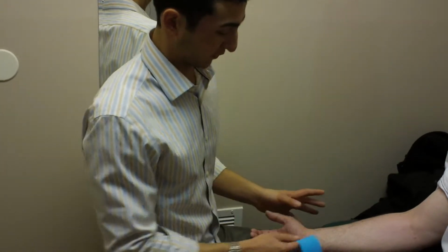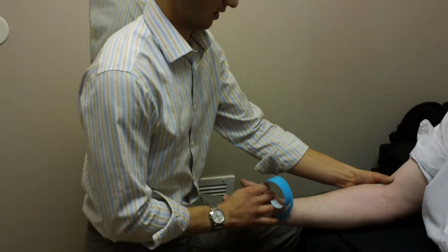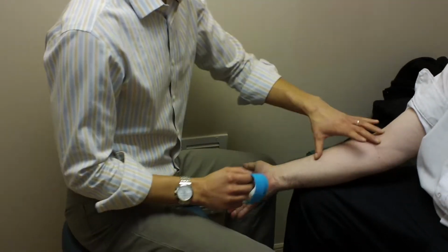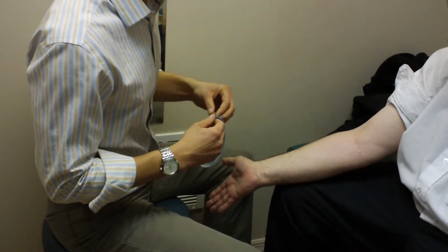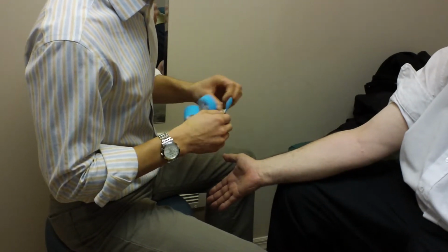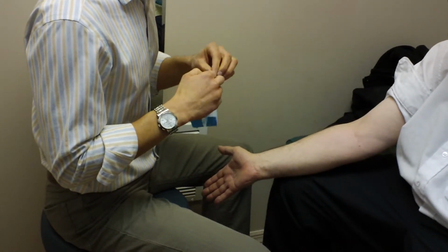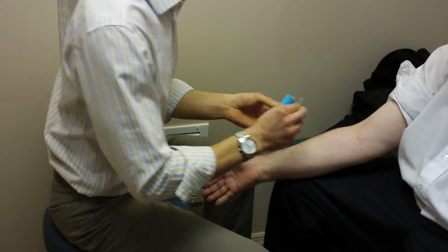Since it really hurts him to move the arm, we're going to take it as far into the end range as we can before pain, so just tell me when. It's like right about there? Yeah. Okay, so we're going to stretch the muscle as far as we can, and we're going to let the tape do the rest of the action. So we flick the edge of the tape off. We want to be careful not to touch the tape so that it keeps the glue.